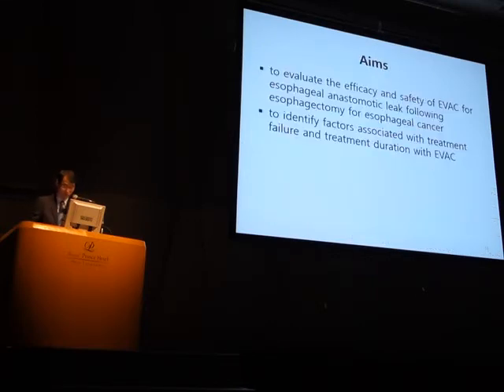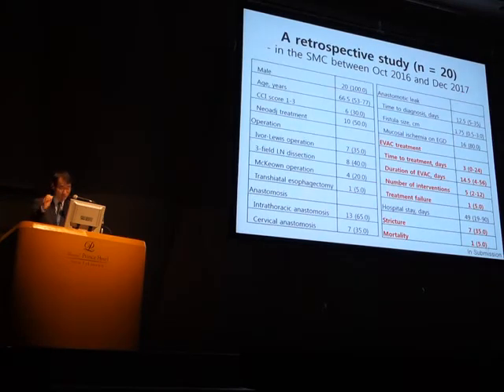Lastly, I will show you our experience. Using a more homogeneous group of patients with anastomotic leak after esophagectomy for esophageal cancer, we tried to evaluate the efficacy and safety of endoscopic vacuum treatment, and we also tried to identify factors associated with treatment failure and treatment duration. We analyzed the initial 20 cases performed in the Samsung Medical Center between October 2016 and December 2017.